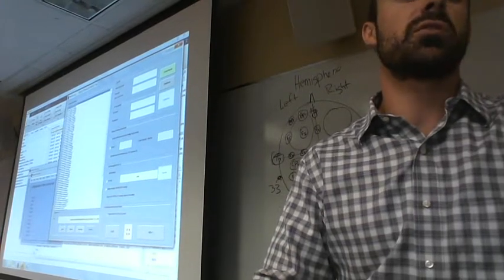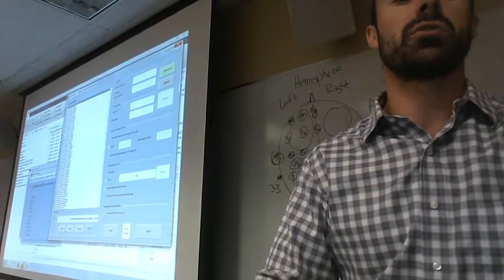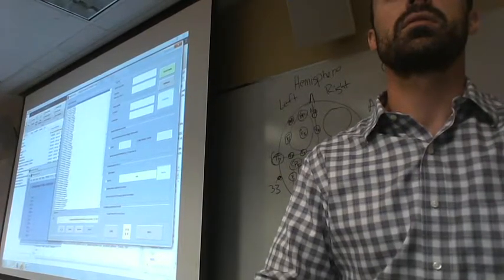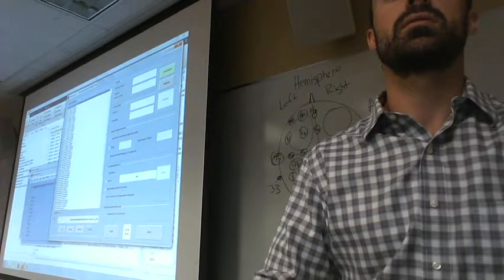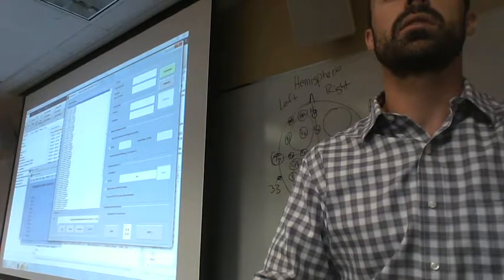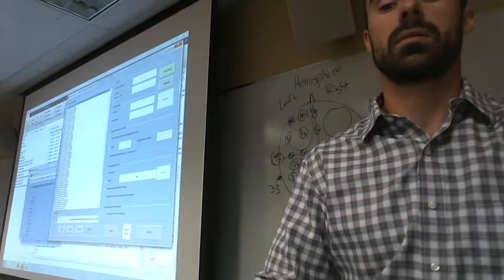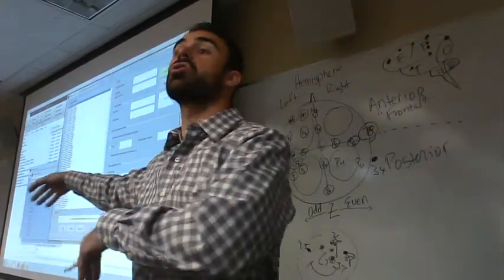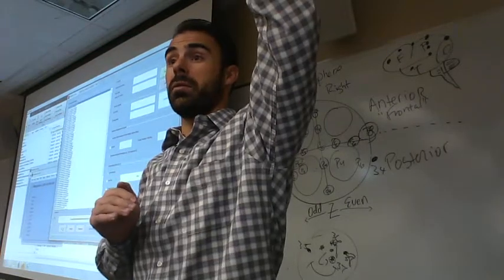This is just for the very first one on that list. It'll probably clear out the first one. I would just load your list down here. Oh, okay. Yes, Val? I was within the end. So event code 6111, event label AN1SCH. Yeah, bin number 1 and bin description. Yeah, that's fine for now.